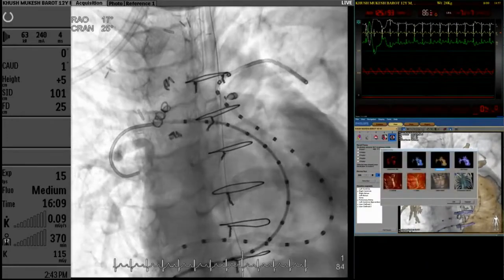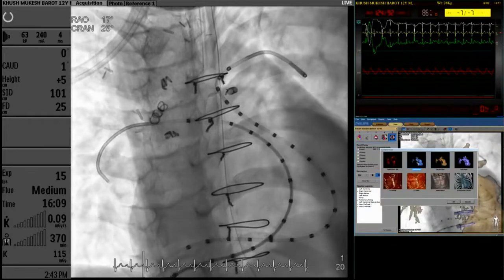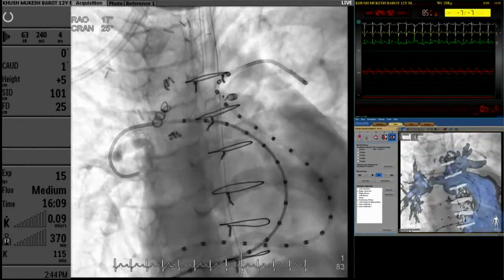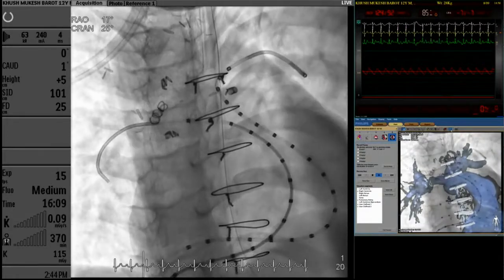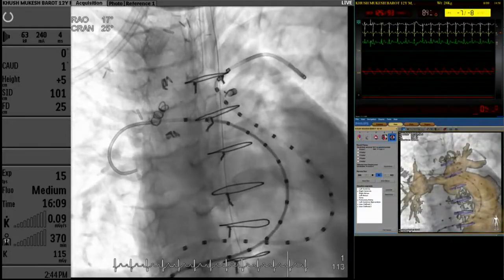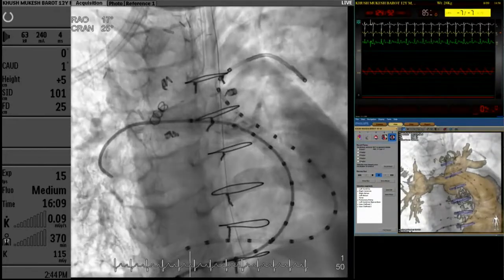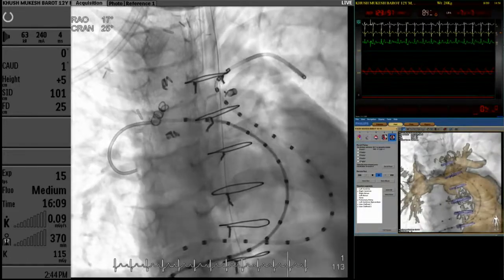And my other concern about the right pulmonary artery stenosis is that it is very close to the bifurcation. So I'm not sure what part of the stent will remain hanging, or whether you're going to commit yourself to one of the branches going lower down with an open cell, and in case you entrap the upper lobe branch, then go through the cell and try and dilate it. I don't know what your strategy is for the right pulmonary artery.